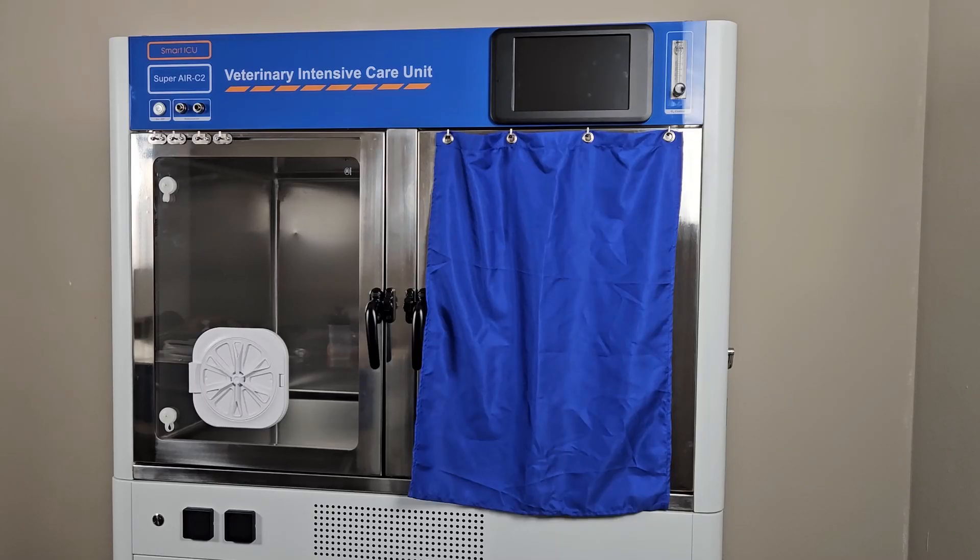Today, we will be walking through the main features and functions of your SuperAIR Veterinary Smart ICU cage. There are multiple configurations for the cage; however, these instructions will apply to any configuration, with differences noted during demonstration.